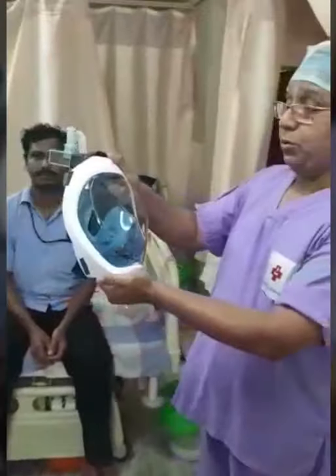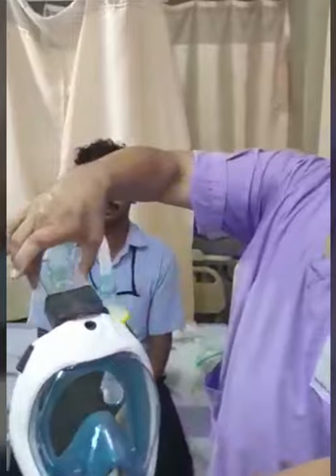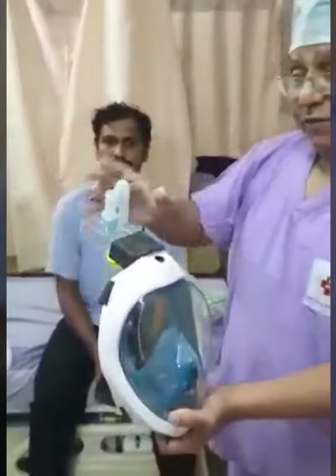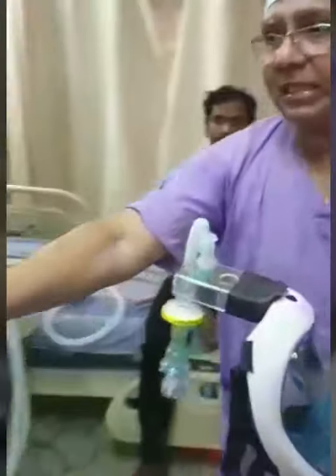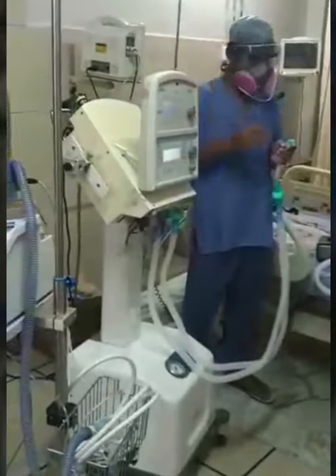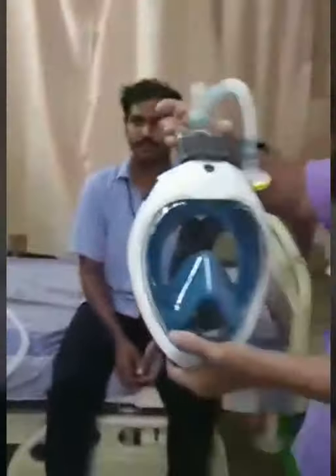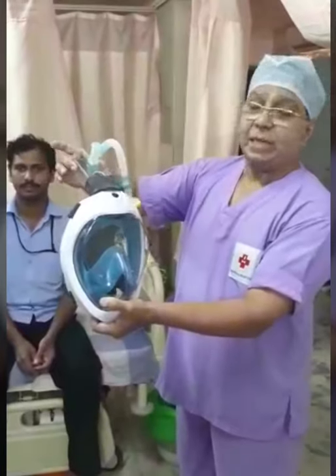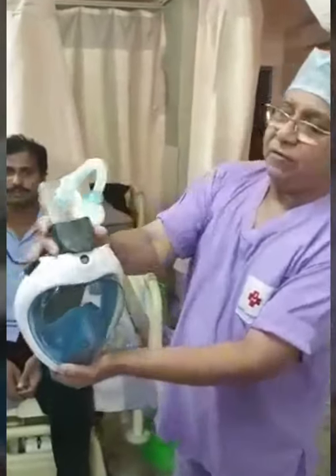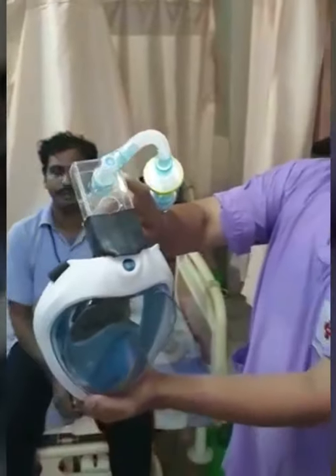Now, I am explaining how to use the same snorkeling mask with a double port connector, and use it with ventilators which have a single hose, or with a high flow oxygen device, or with a BiPAP/CPAP machine. The only change is: instead of the single port connector, we fix the double port connector. There are two ports here — one is inlet and one is outlet.